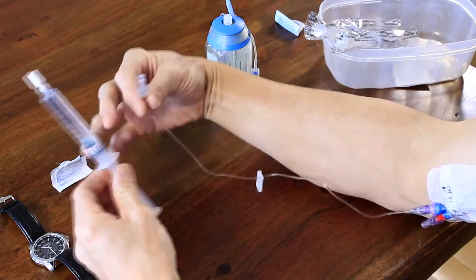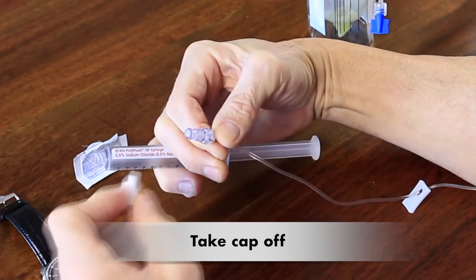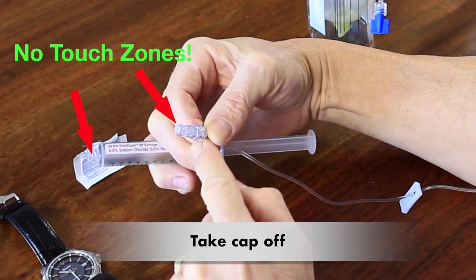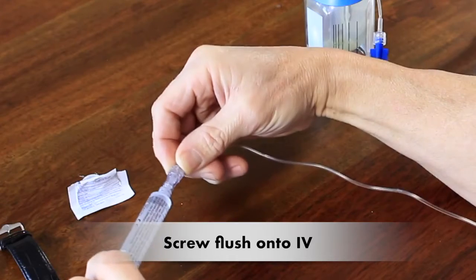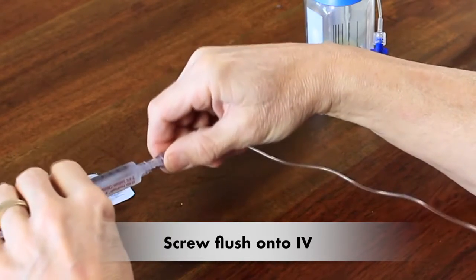So now you need to flush your IV. So take the cap off the flush, and the tip now becomes a no-touch zone. So you can't touch it with your fingers, or it can't touch the table or your arm. And of course, that clean cap is no touch. So the only thing that can touch no touch zones is another no touch zone. So now you're going to push and twist the flush onto your cap.